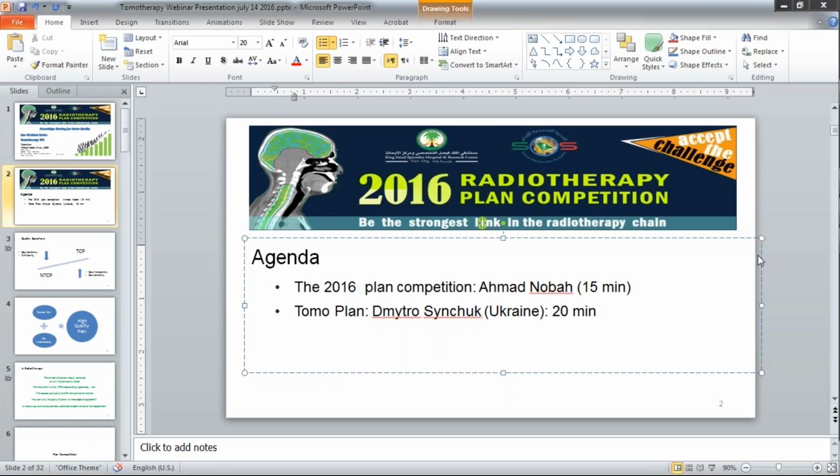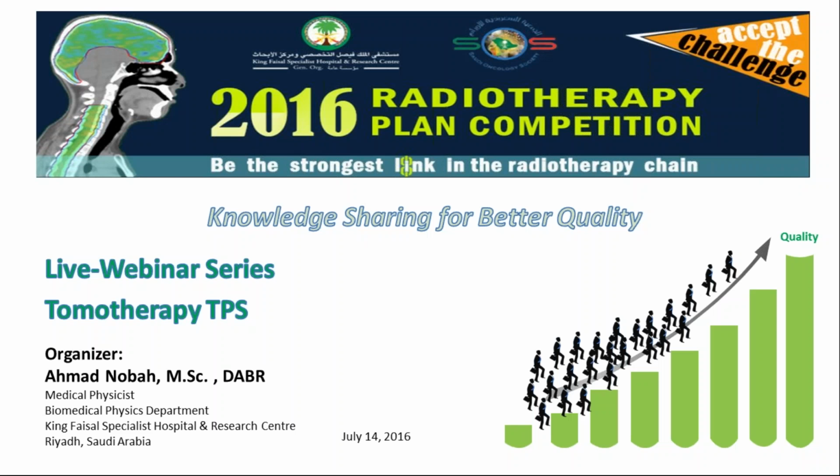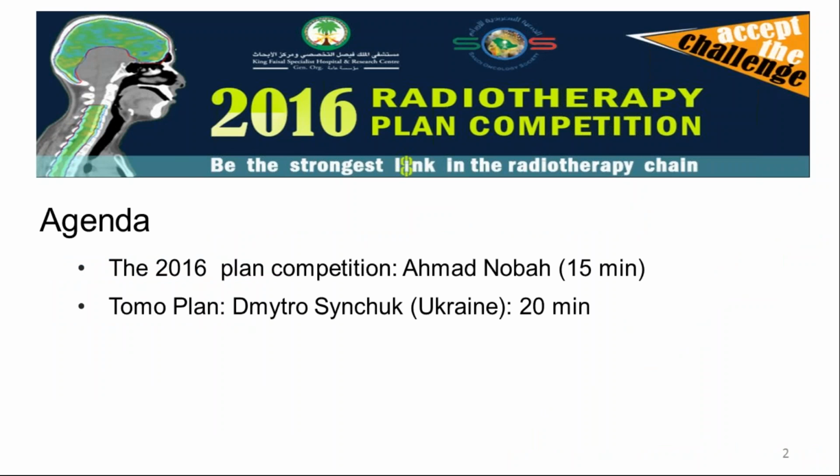And our webinar today will be about the tomotherapy treatment planning system. So we'll be sharing some tips about the tomotherapy treatment planning system in our competition. But I will start in the beginning to talk about some introduction.